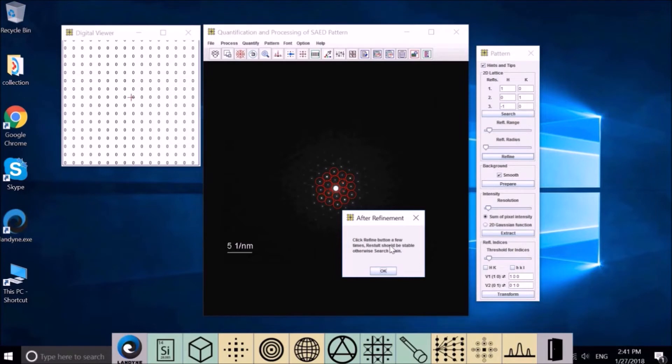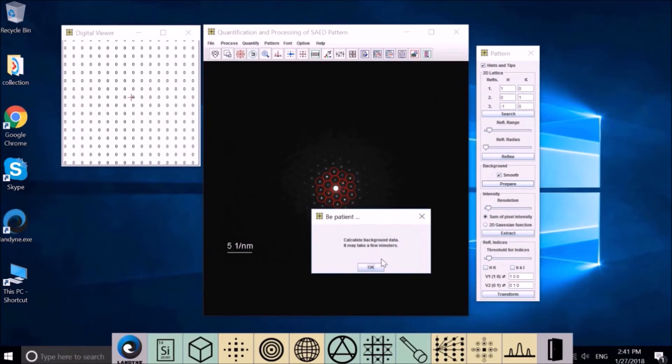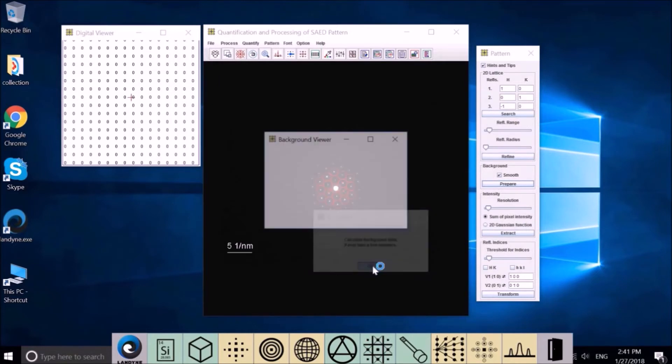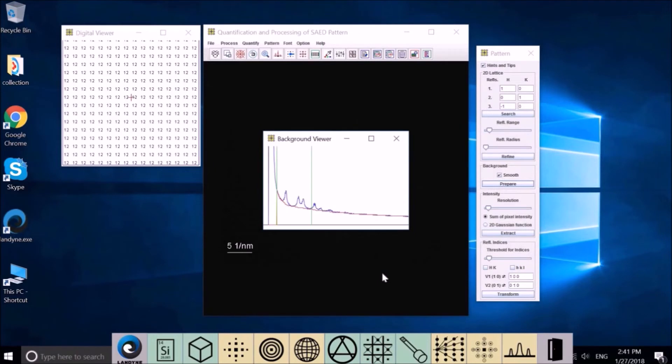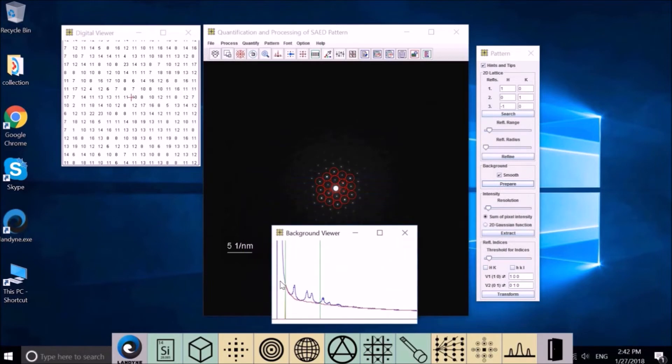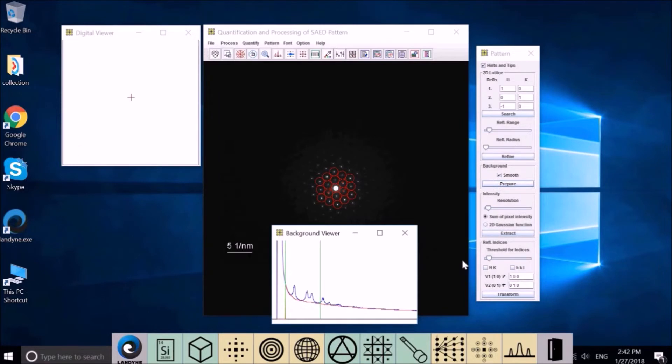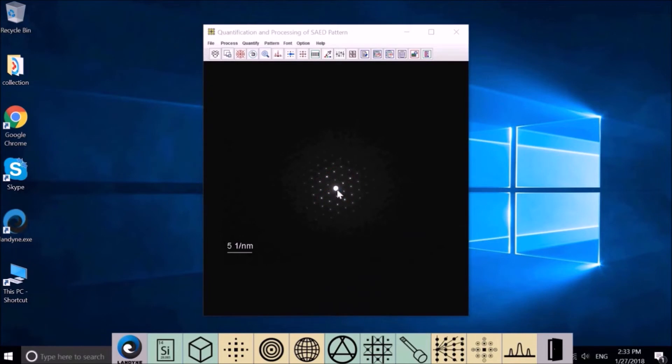Let's define the basic vectors. Smoothing - prepare the background. Calculate the background data. It may take a few minutes. This is the background. This is the peak. The red one is the background. So it's okay.